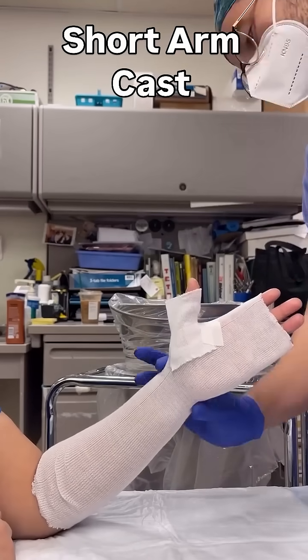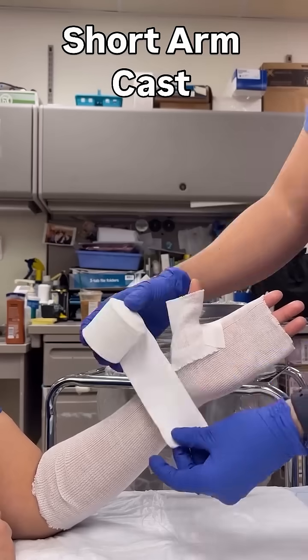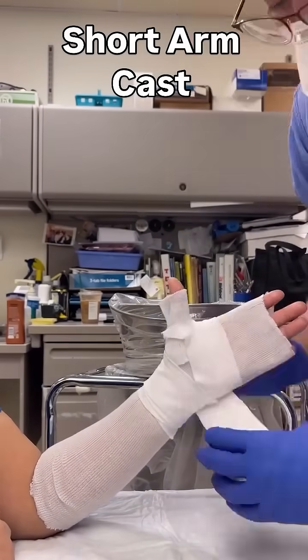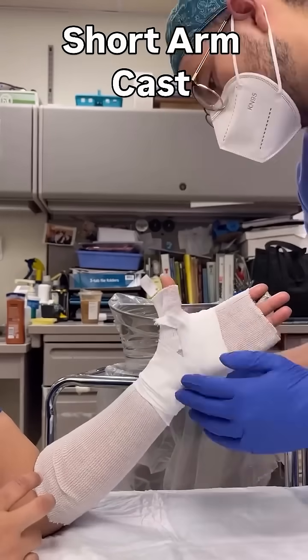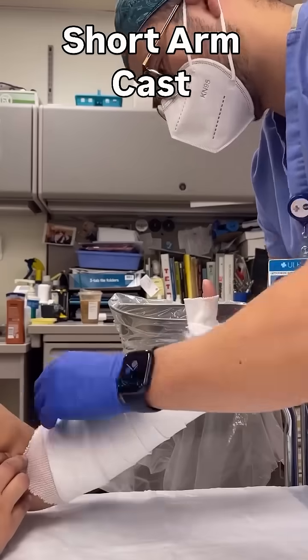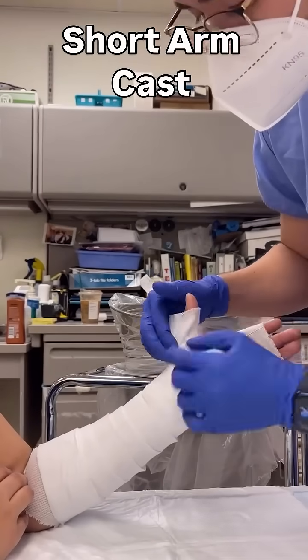When wrapping with the web roll, palpate the radial and ulnar styloid and wrap three times around it to keep the bony prominence well padded. Move to the hand and then down the forearm, and when you reach the proximal border, wrap three times more, as that will be where you will fold the edge of your cast.